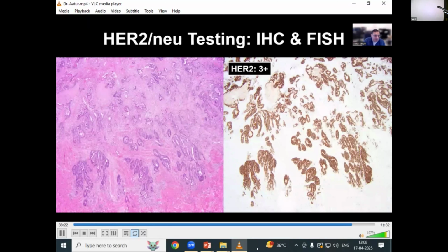Another antibody that we often use, especially with advanced ampullary adenocarcinomas, because we know that they're associated with poor prognosis, is HER2 testing. And so HER2 testing, honestly, we find very useful. About 10% of our ampullary adenocarcinomas have an ERBB2 or HER2 3+ positivity.